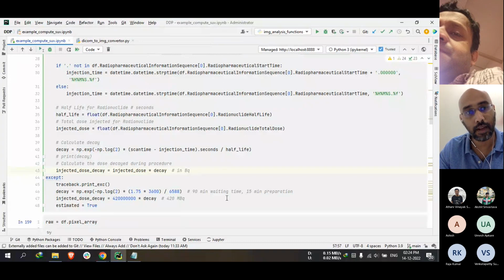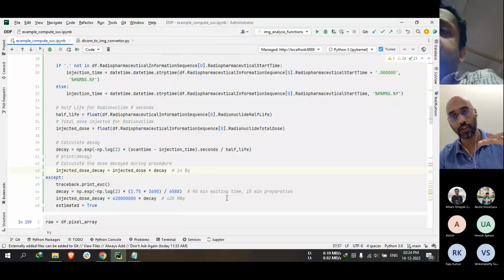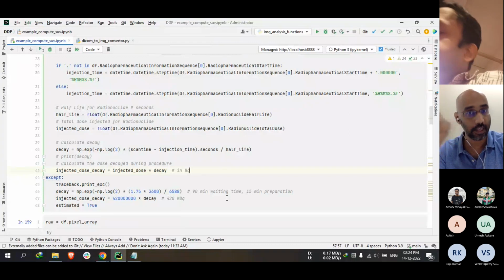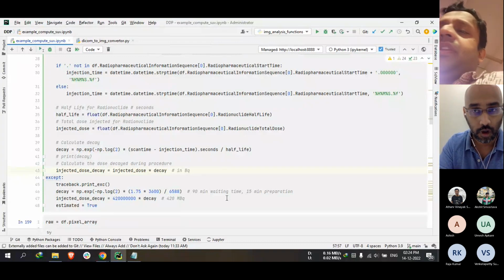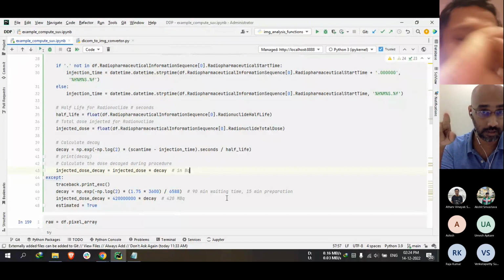So first we will be looking at the idea that we are currently following, Professor Ganesh. We are looking at the SUV levels for each coronal section. We'll try to find the maximum intensity and then correlate it with the coordinates of the CT scan images to find in which specific organ it is highest. That is the next step that we are looking at. So Atharva's next job is now to actually segment individual organs, right, Atharva?